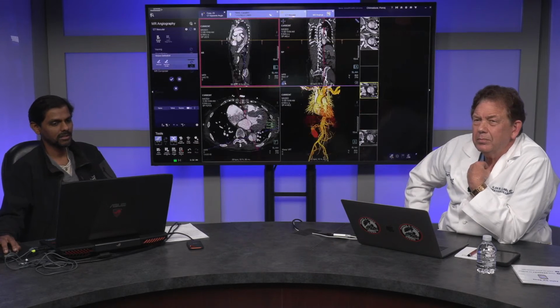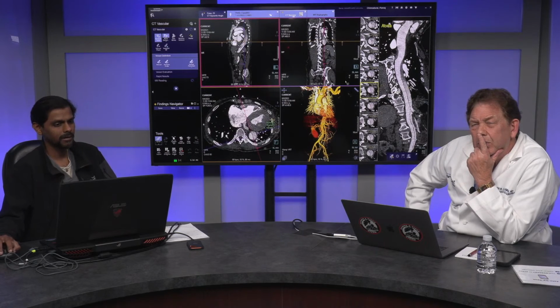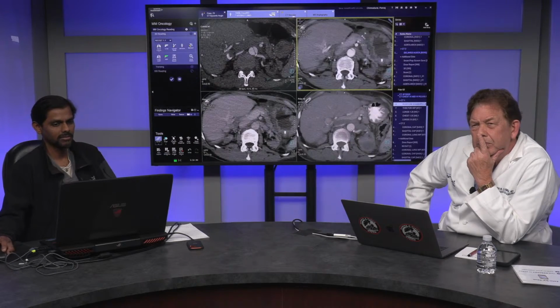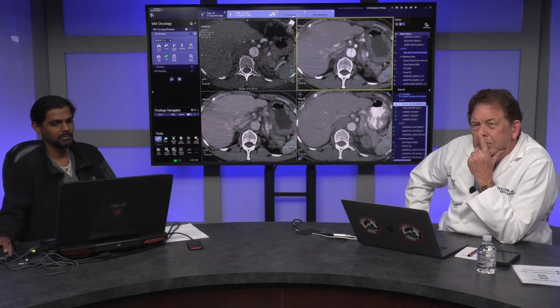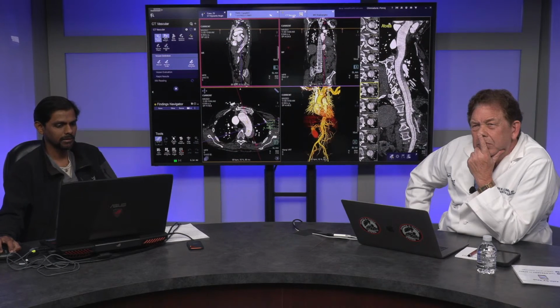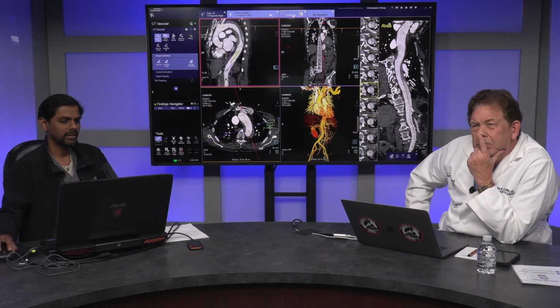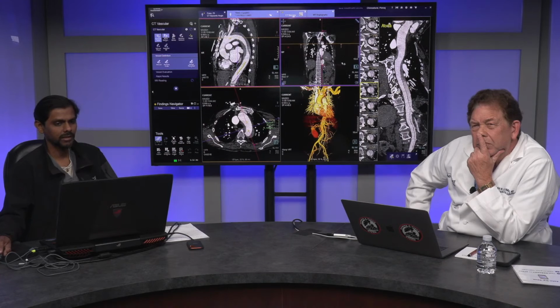So this patient also got, so I'm just going through the same CT images in multiplanar view. What I've shown here is just an axial to compare it with previous imaging modalities. Here now you can interrogate the aorta in a multiplanar view and really look for any entry tears in the proximal descending aorta.